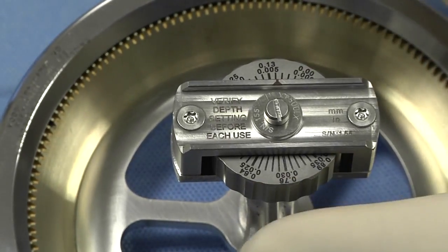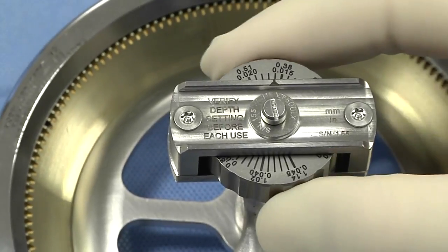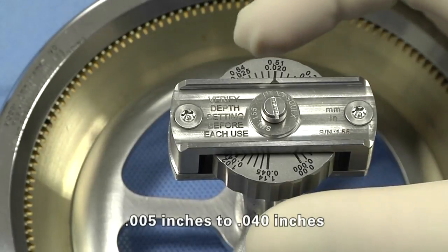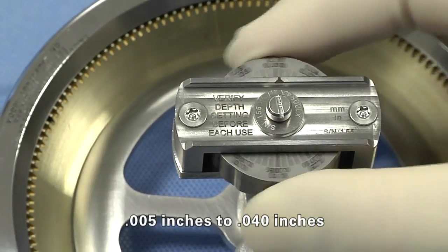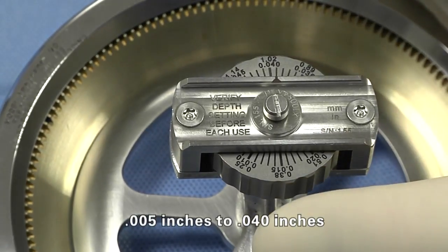Settings on the depth adjustment knob indicate increments of thousandths of an inch and will cover the specified range. Note: the depth settings are a guide, and the resulting skin graft will depend on donor demographics and processor protocols.